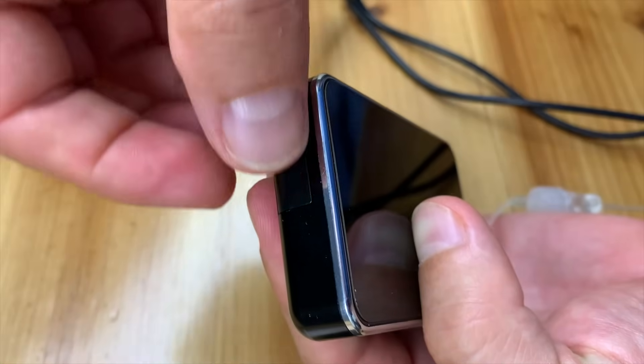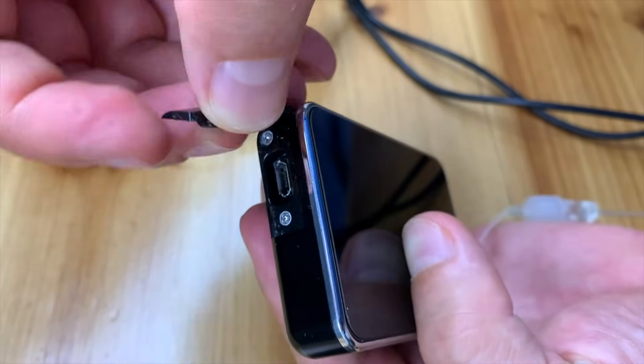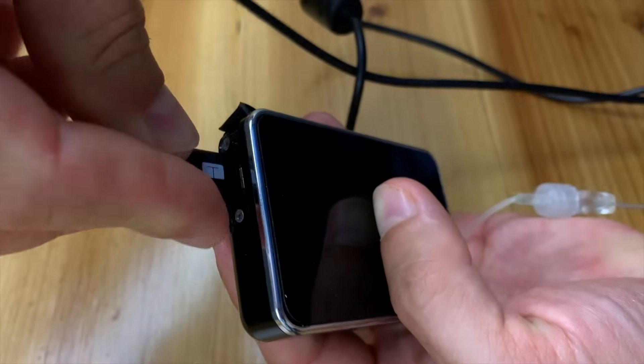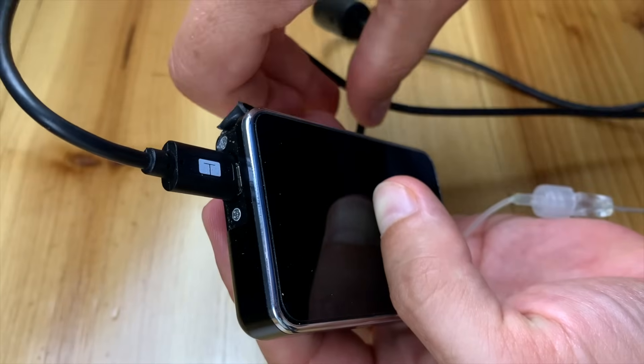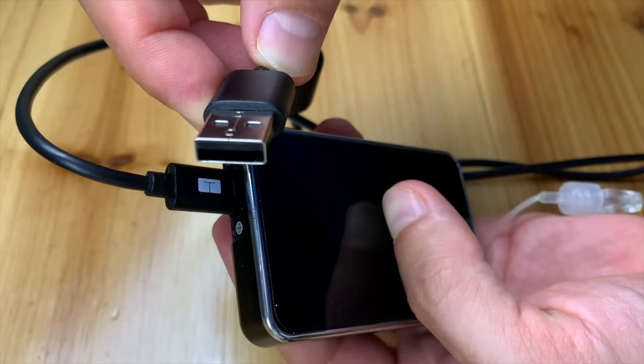To get to the USB slot on the pump you need to open a little plastic cover, which is not the highest quality in the world — mine broke about a year after I started using the pump. Another con is that when you travel and forget your charging cable you're in trouble, because it's not easy to find a compatible charger and cord, especially if you're in a remote location.